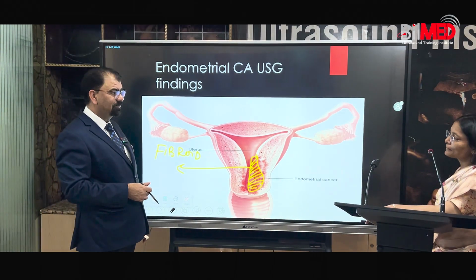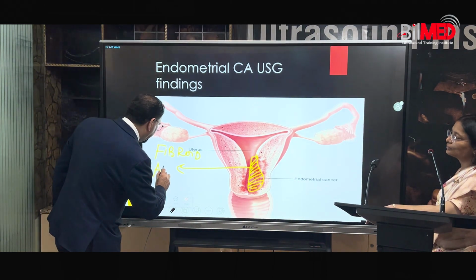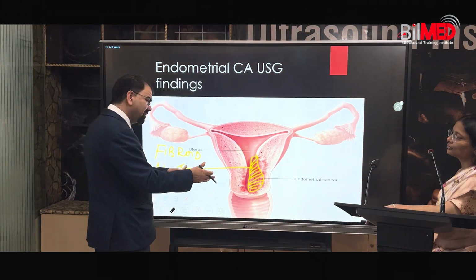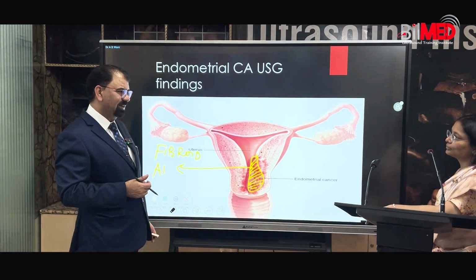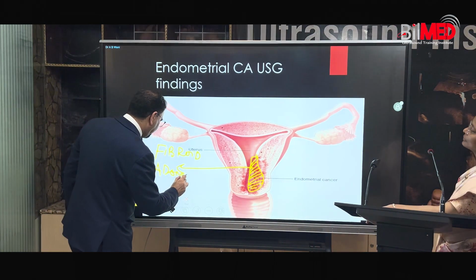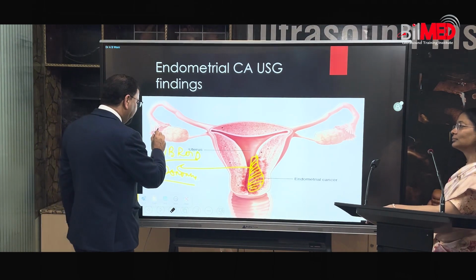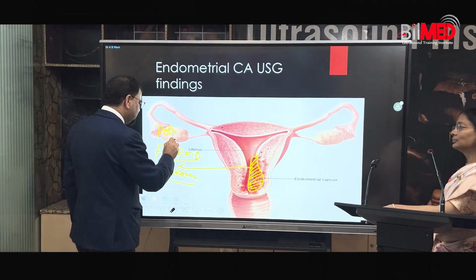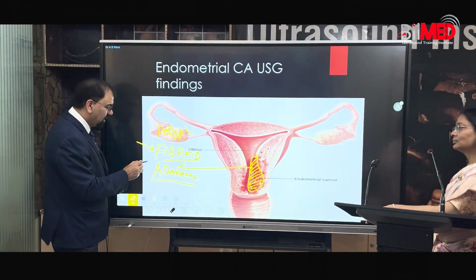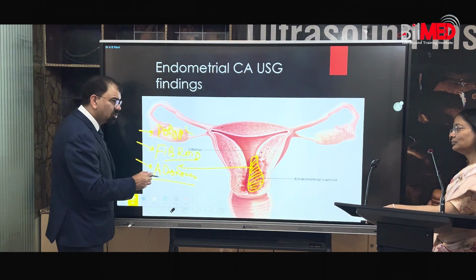This can be a fibroid. Second, adenomyosis. Can I not have an adenomyotic patch near this area? And I am unnecessarily thinking along all lines of endometrial CA. Try to understand first. An adenomyotic lesion can be there. Can there not be a polyp? Now I have to be very clear about the polyp first, fibroid first, and adenomyosis also.